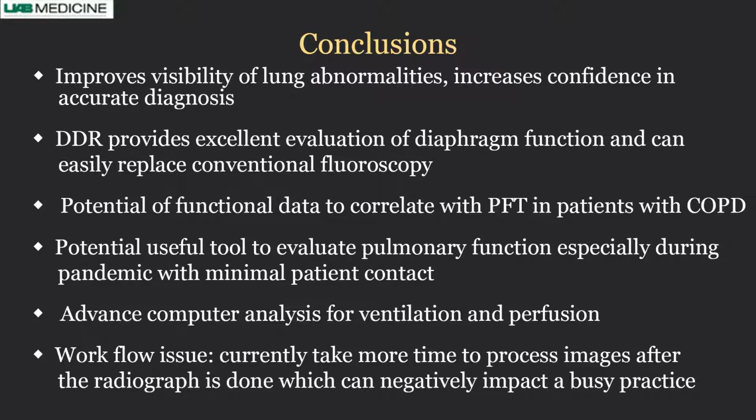As I said before, currently there is a workflow issue because it takes more time to process those images after the radiograph is done. And I am told that, just like with any new computer, newer versions come with faster processing speed, and this time will be decreased with the newer versions. And I think that will help decrease the negative impact on the busy practice.